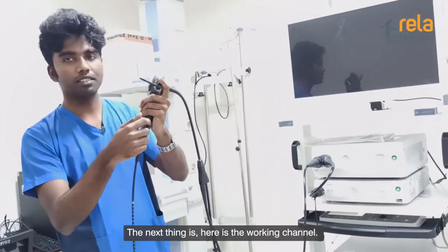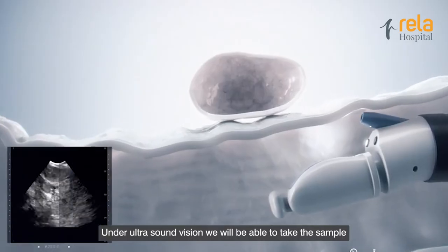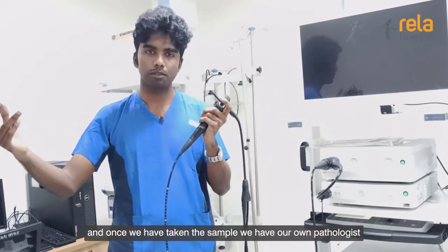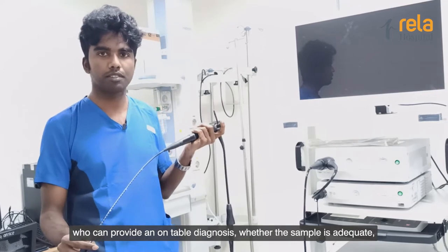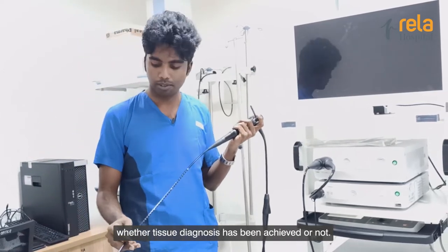The next thing here is the working channel. Through this, we'll pass the needle for the FNA or the biopsy. So under ultrasound vision, we will be able to take the sample. And once we have taken a sample, we have our own pathologist who can provide an on-table diagnosis — whether the sample is adequate, whether the tissue diagnosis has been achieved or not.